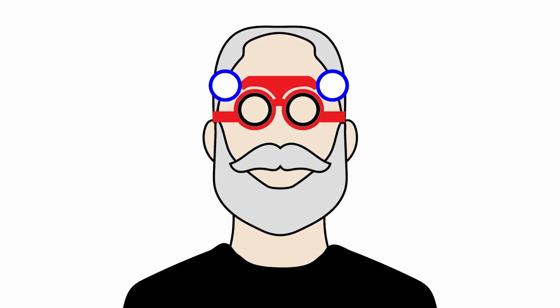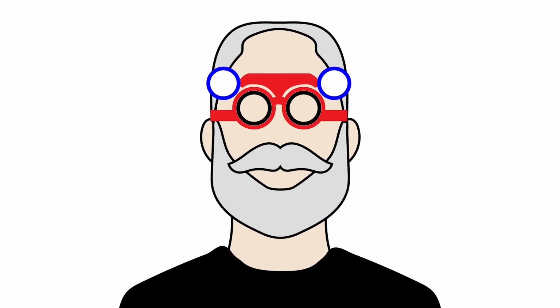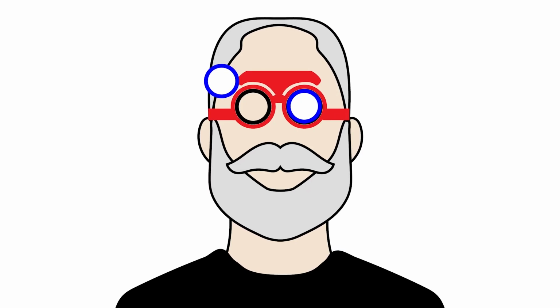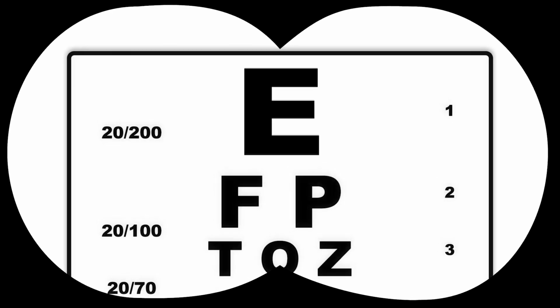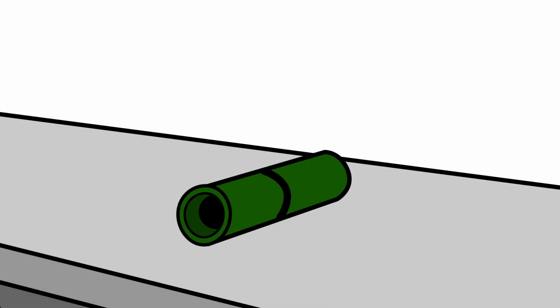Another low vision exam that tests your distance acuity is called trial frame refraction. For this one, you wear a pair of glasses that have openings for lenses, and the doctor slides in different sets to see which ones work best for you. This is a lot like using a phoropter, but wearing these glasses gives you a wider field of view, so you can use more of your vision to find what prescription is right for you. These tests also help your doctor understand whether another device might be helpful, like a monocular, for seeing things at a distance. Check out our workshop on monoculars and telescopes to learn more.